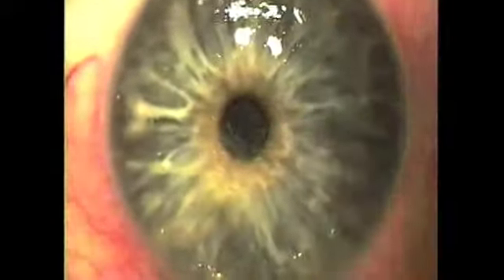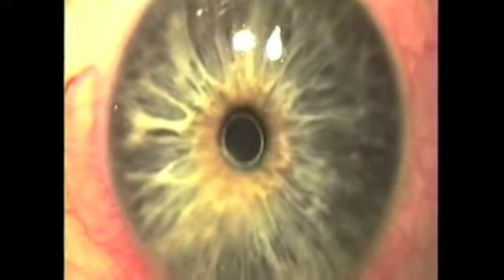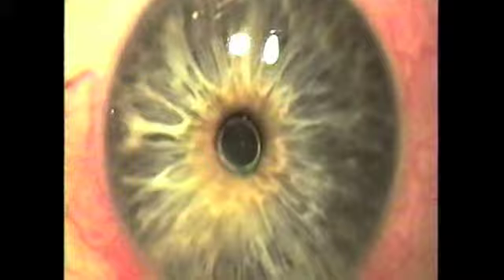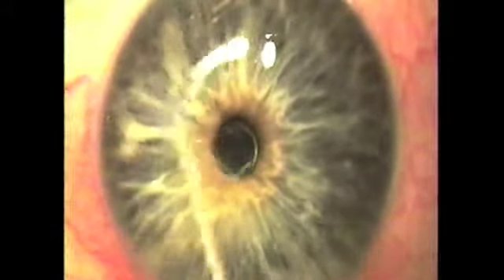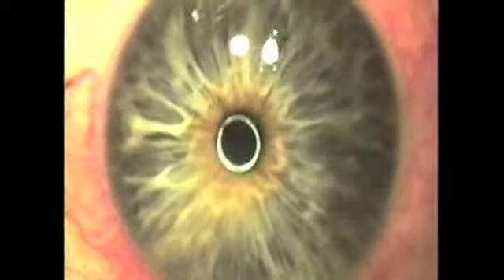At this point, we will apply mitomycin C for about 30 seconds. You may even rub the surface or gently place this disc-shaped wax soaked in mitomycin so it applies to the central cornea. Notice now, on application of BSS solution, the light reflex, which was D-shaped, has now become circular. This translates to vision.